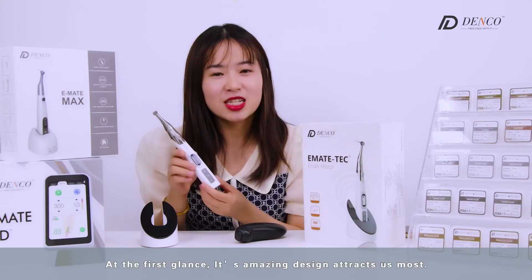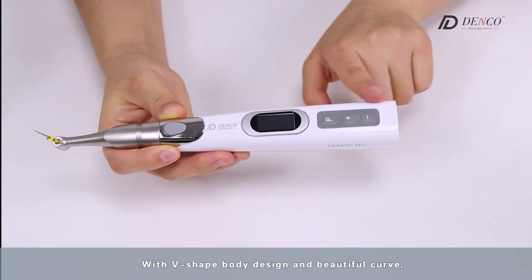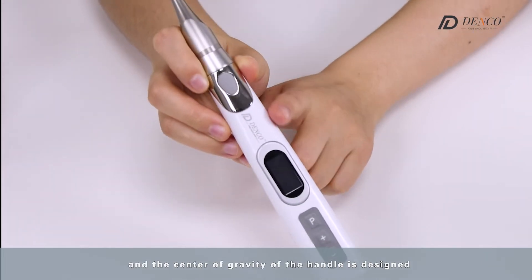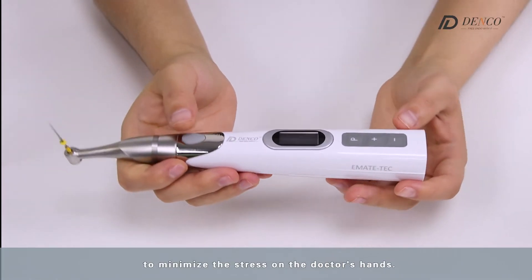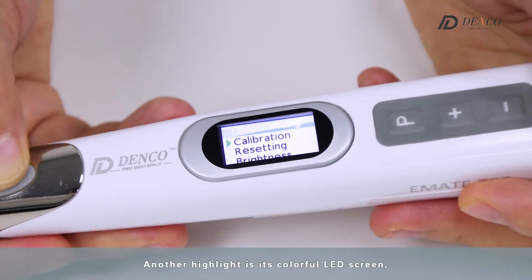At the first glance, its amazing design catches us most, with a V-shaped body design and beautiful curve. The grip is ergonomically designed, and the center of gravity of the handle is designed to minimize the stress on the doctor's hands. Another highlight is its colorful LED screen.